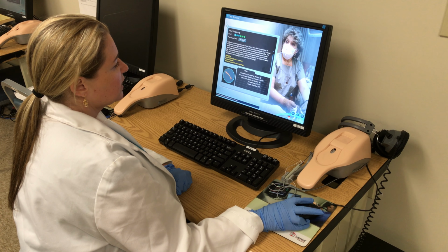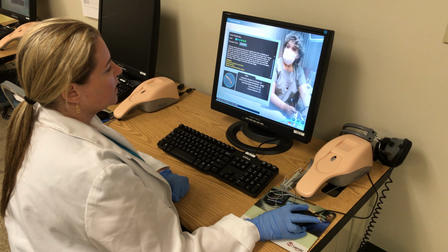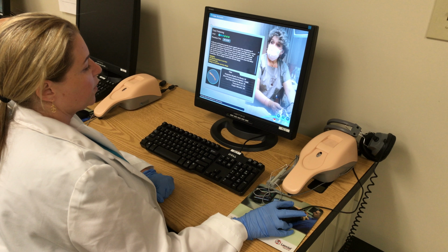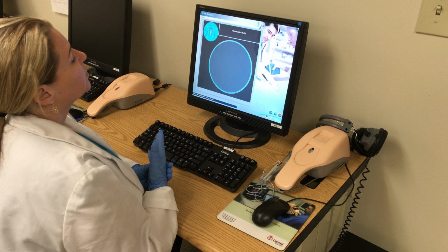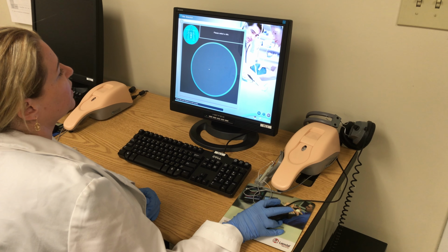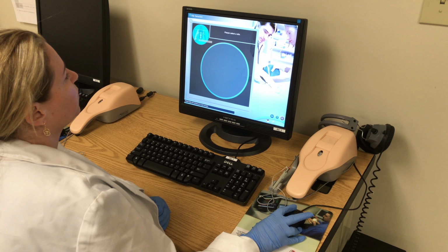These are her vital signs. Respirations are 20, BP is 146/90, heart rate 96, temperature was not taken, and oxygenation was not recorded. You're going to click your arrow to start your scenario. So the student is going to want to pick what site is best for this scenario. So you can click either the left or the right arm.